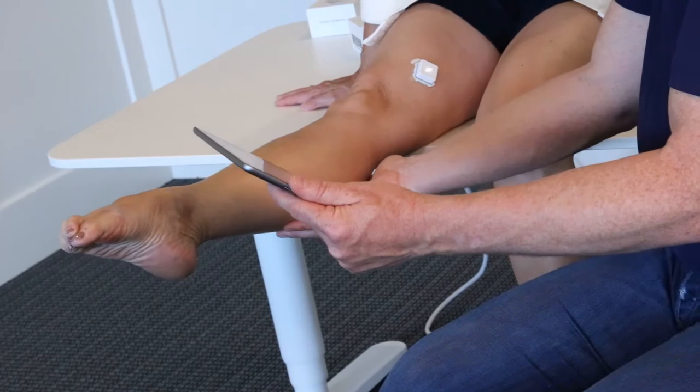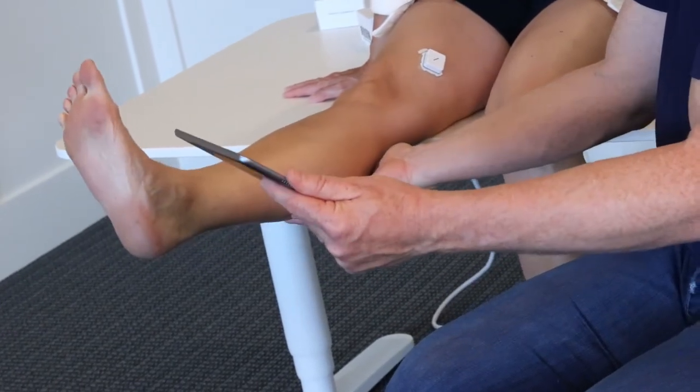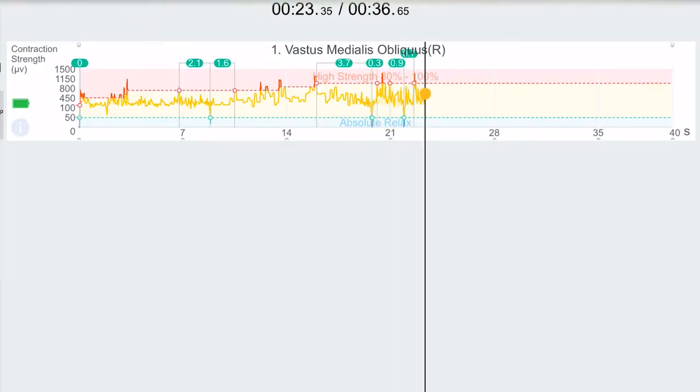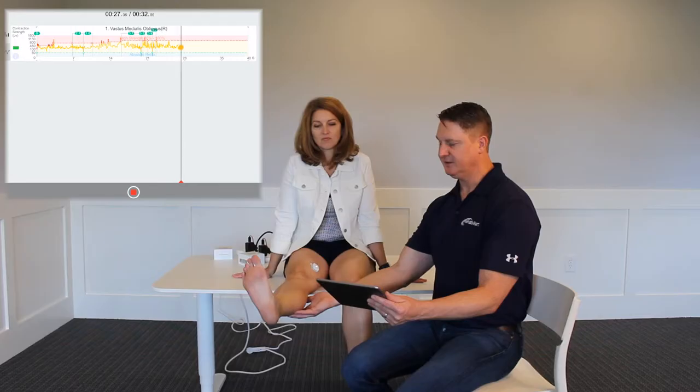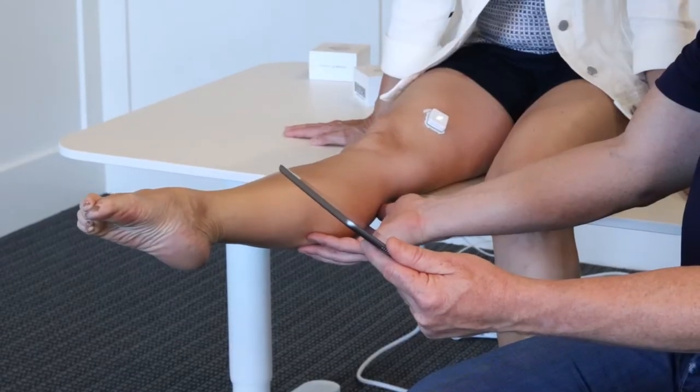Now let's see what happens if you dorsiflex the foot — can you also continue to contract? Let's see what type of contraction we can get. Not near as much — we're getting about 200 microvolts. Let's plantarflex the foot. With plantarflexion, we're seeing we're actually doubling the microvolts.